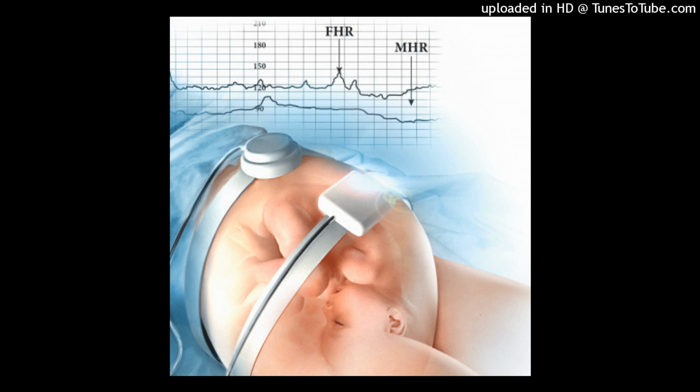Abnormal baseline FHR, tachycardia, greater than 160 BPM. Physiologically, increases in sympathetic or decreased parasympathetic tone cause tachycardia. Potential causes of FHR tachycardia are presented in box 14.1. Bradycardia, less than 110 BPM. Physiologically, increases in parasympathetic and decreases in sympathetic tone cause bradycardia. The potential causes of FHR bradycardia are presented in box 14.2.